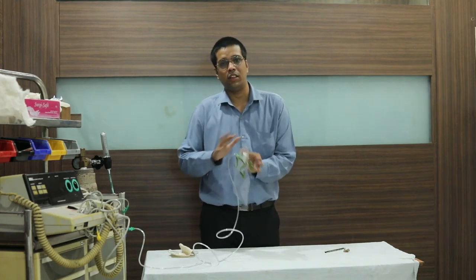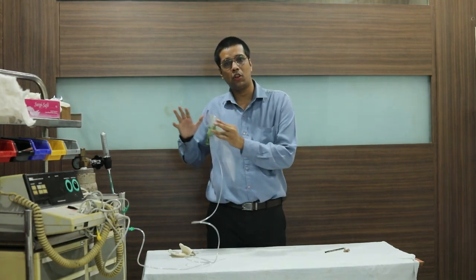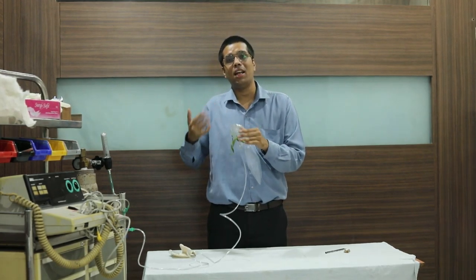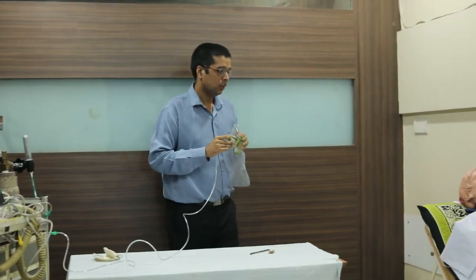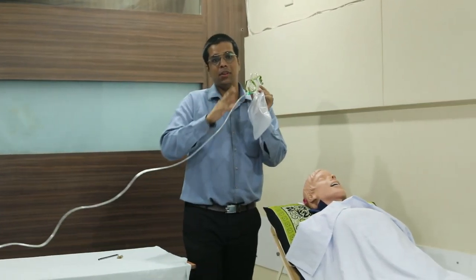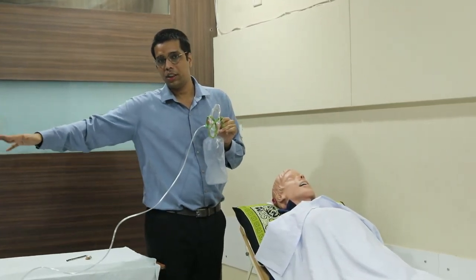We have covered multiple things and learned the theory part. Now let's learn how to apply a non-rebreathing mask on a patient. I have connected the NRBM to the flow meter and set the flow to 12 litres per minute.